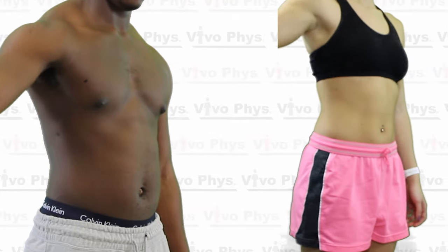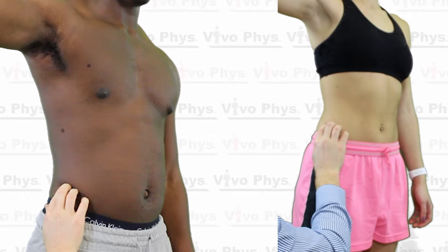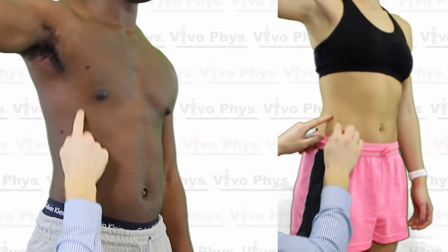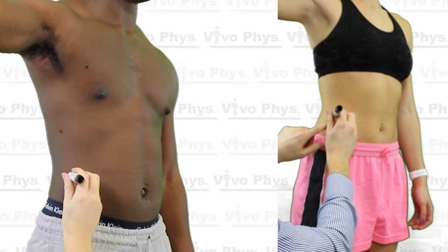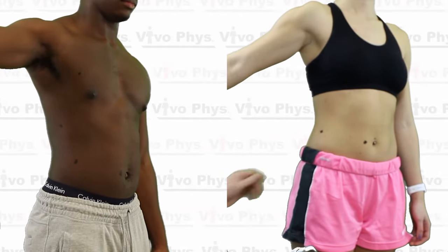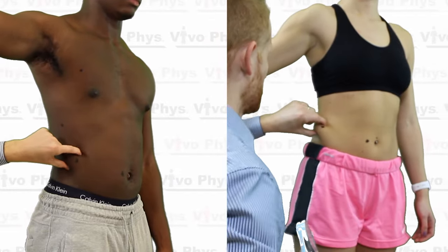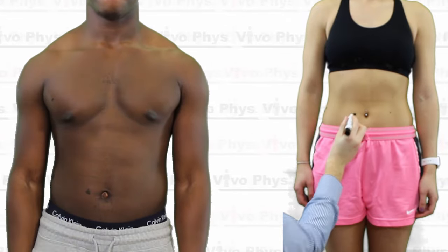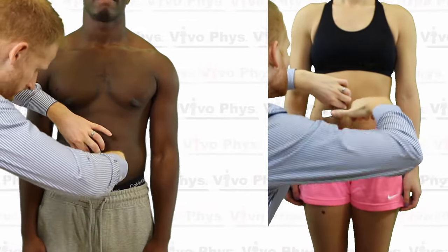The suprailiac skin fold site is going to be on the right hip of the individual. You need to palpate and try to find the iliac crest. Once you can trace where the iliac crest is, look for where the front of the armpit is and go directly down from that — so it's going to be sort of on the side of the individual. A lot of people do this far too close to the front of the individual. It's about an inch or so off of the iliac crest in line with the front of the armpit, and this is going to be a diagonal fold. The abdominal skin fold site is going to be about one inch or two centimeters to the right of the belly button, and this is going to be a vertical fold.